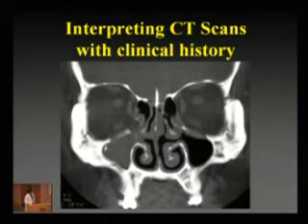If this is a patient with previous surgery, this is a patient who has previous FESS surgery, and as PJ has mentioned, orbital penetration is quite common. It is one of those patients with previous surgery, orbital penetration, and then residual sinusitis, probably due to inadequate surgery after you have penetrated the orbit.